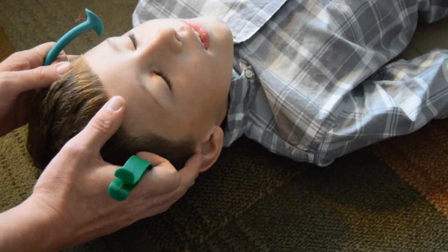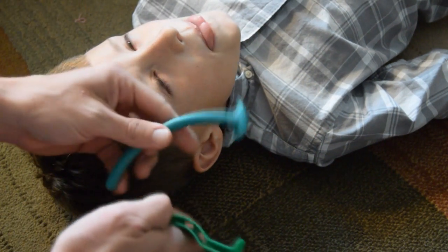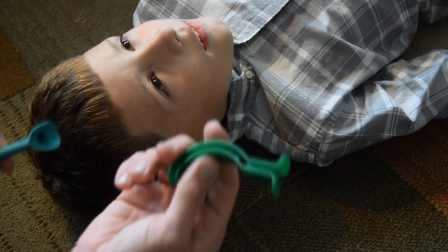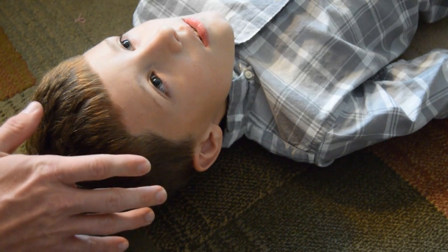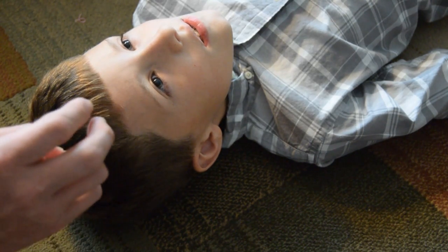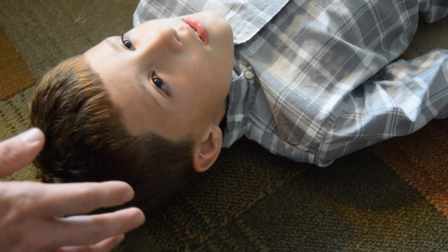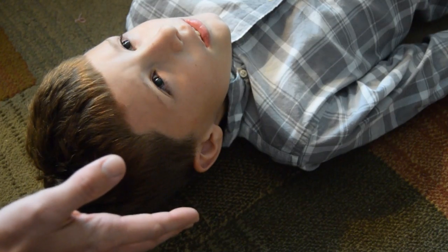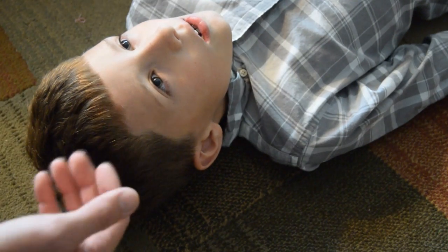So you have someone who's unconscious and you're trying to choose which airway adjunct to insert — this one goes into the mouth, this one goes into the nose. We're going to determine if our patient has an intact gag reflex. There are two ways to do this, and both of them operate on the cranial nerves. The gag reflex and the eye reflex do not use the same cranial nerves, but they're close in nature.